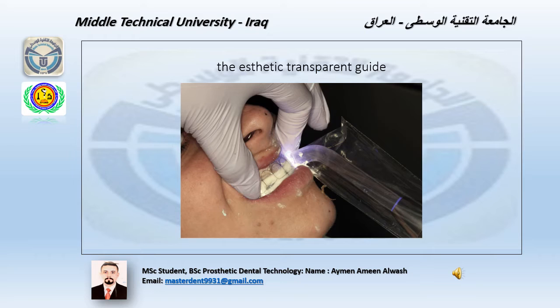For check the smile and level of 6 anterior teeth inside the clinic.